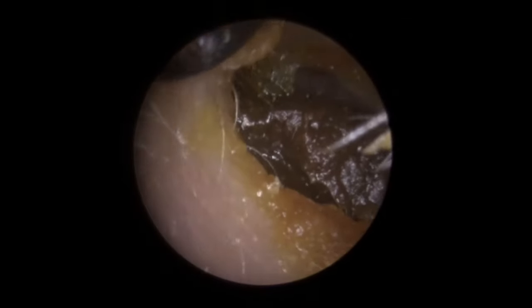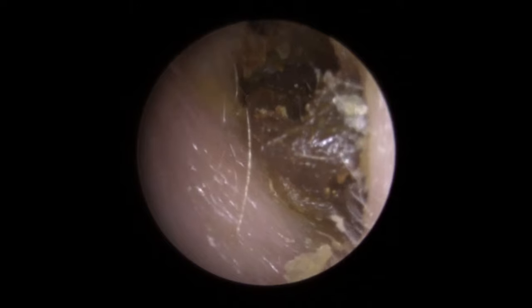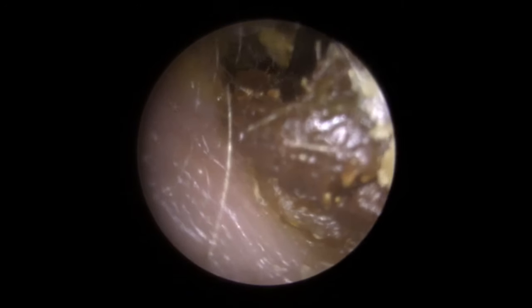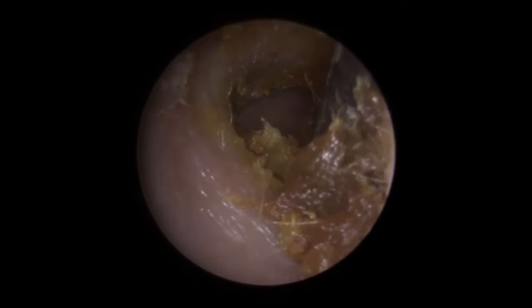So this is the same patient but their second ear. What you can see is we do have this little blob at the bottom, with a nice gap at the top. Let's see if we can use the same technique as before — just get behind it and slowly bring this down, hopefully pulling the rear end of that wax further down the canal to make it easier to get out. You can see it's not quite as hardened up on this side — there's still a little bit of softness, a little bit of squishiness. As we pull forward, it just bent the wax forwards rather than bringing it from further back. So I'm just going to gently get behind the next section now.